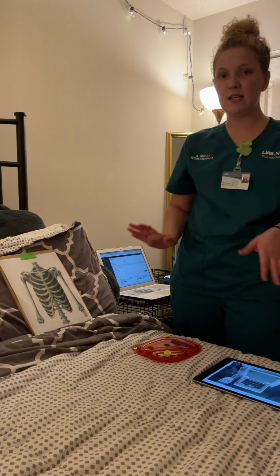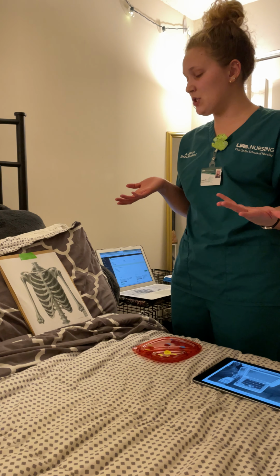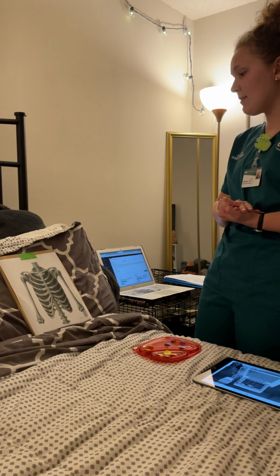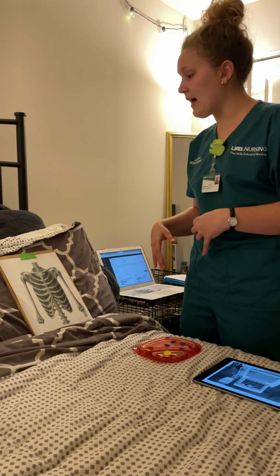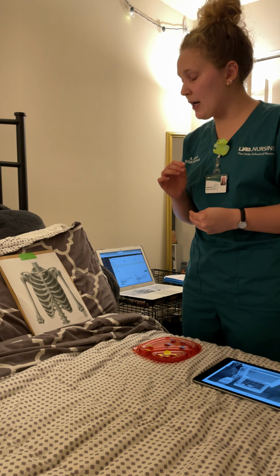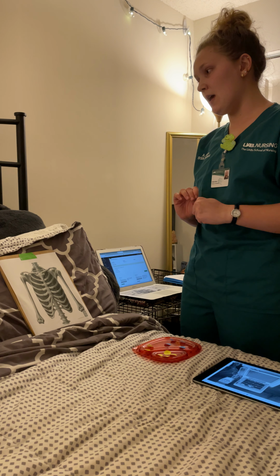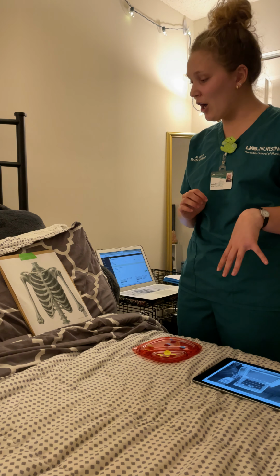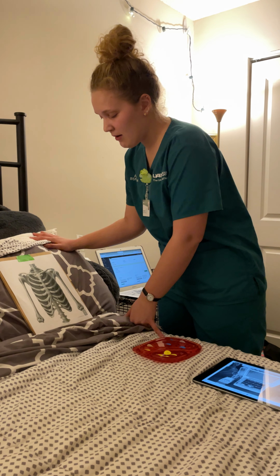Perfect. Okay, so the first thing I would do is pull the curtain for privacy. I would raise the bed up to a working height for myself as well as the table beside me. Mrs. Gee, I'm going to lay you back so you're nice and flat, and I'm going to expose your chest and put a total of 10 stickers on your chest, and then we'll take a picture of your heart rhythm, and then that'll essentially be the entire procedure. Is that okay? Wonderful. So I'll lay you back.